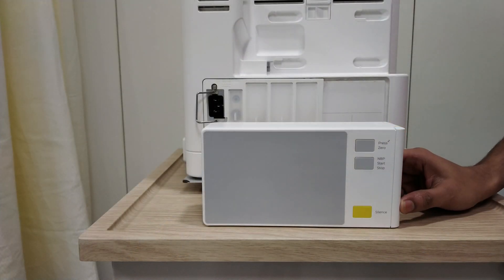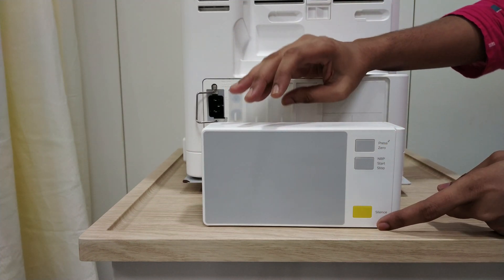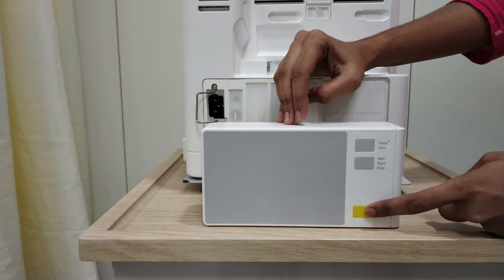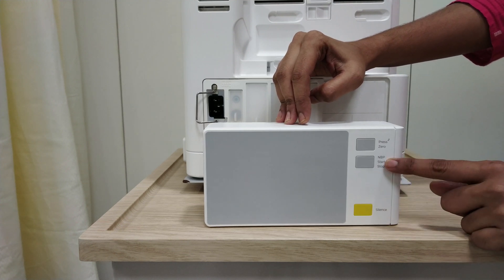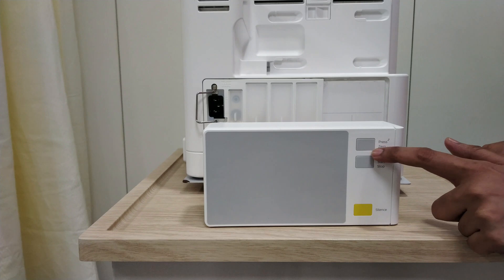This is your MMS server — MMS stands for Multi-Measurement Server. Here are a few software keys. You can silence alarms from this MMS server as well. Then you can start and stop your NIBP, and for zeroing and filter, you can press this key.